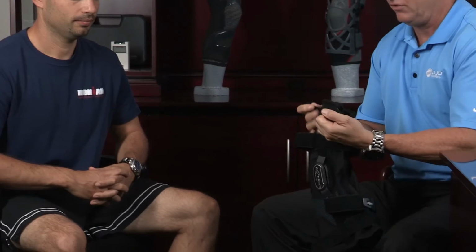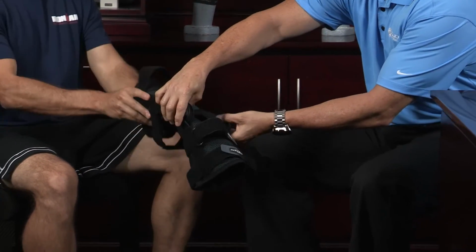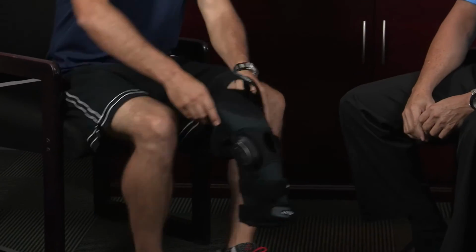You can see the Velcro is very aggressive, so while it's on, it's going to stay on. There we go, Nick. Slide it on. Slide it right on.